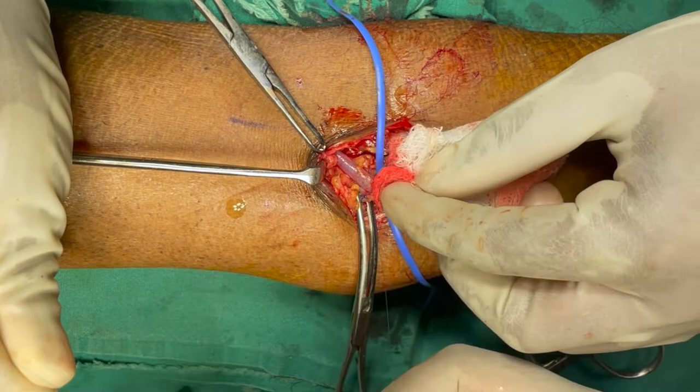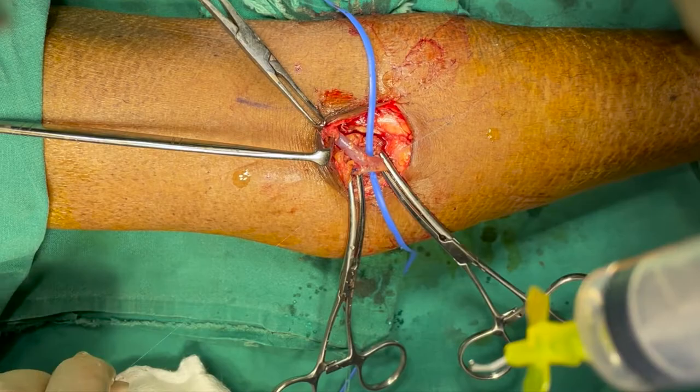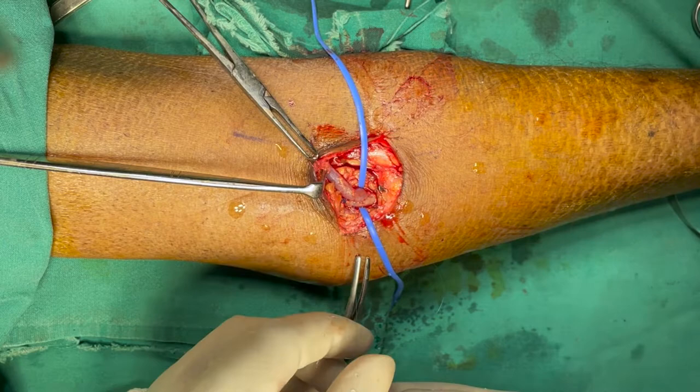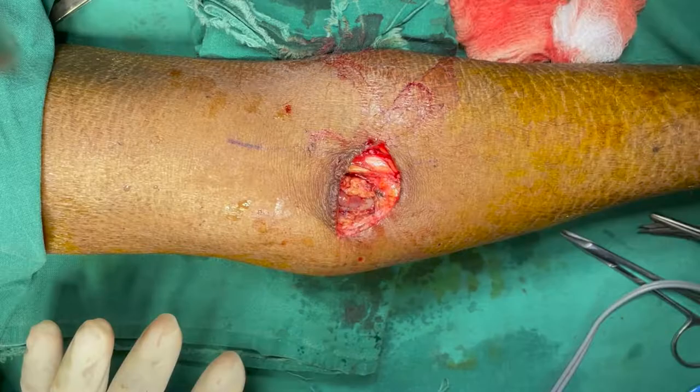Now tie the knot carefully and cut it. Skin is closed with 3-0 nylon.